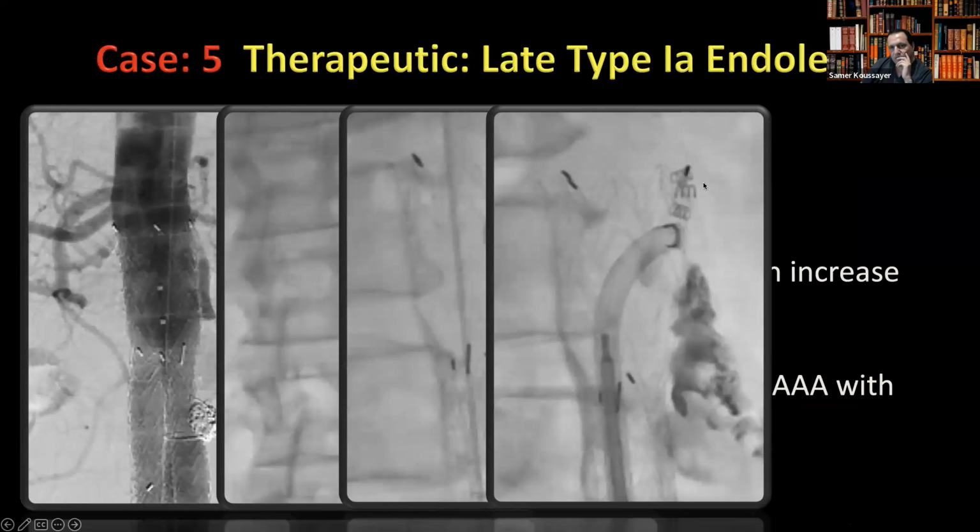Like you see, the first row has to be here. You see where's the end? It has to be here. This is the second, because this is a leak, I'm putting a lot of them around the leak. But usually it has to be in this area here, very close to the tip, like this level.